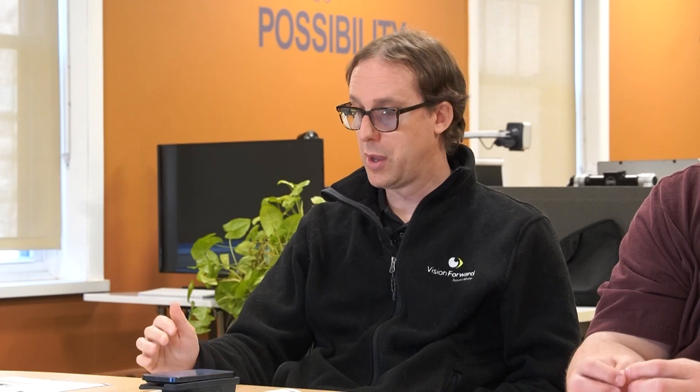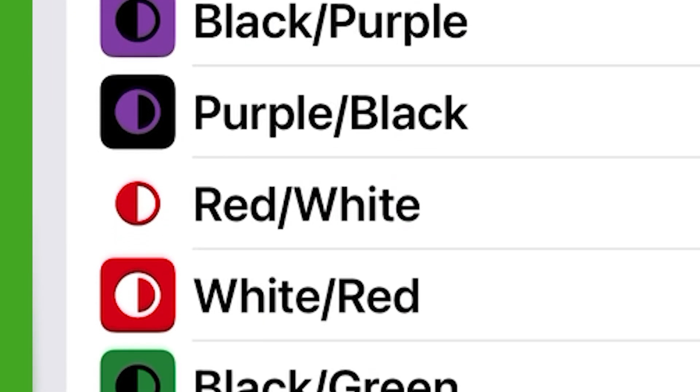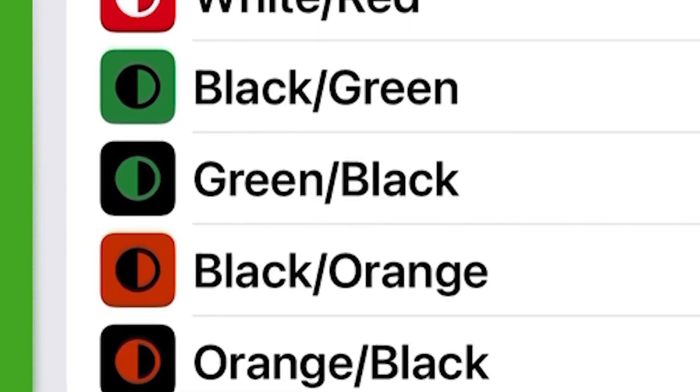Other color options include: black-yellow, yellow-black, blue-yellow, yellow-blue, black-purple, purple-black, red-white, white-red, black-green, green-black, black-orange, and orange-black — plenty to choose from. Any colors you enable will be available when cycling through using the color button.